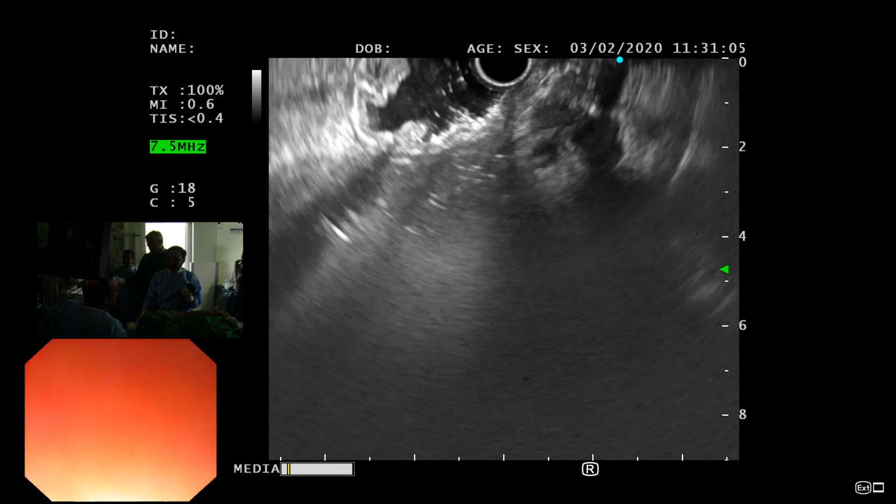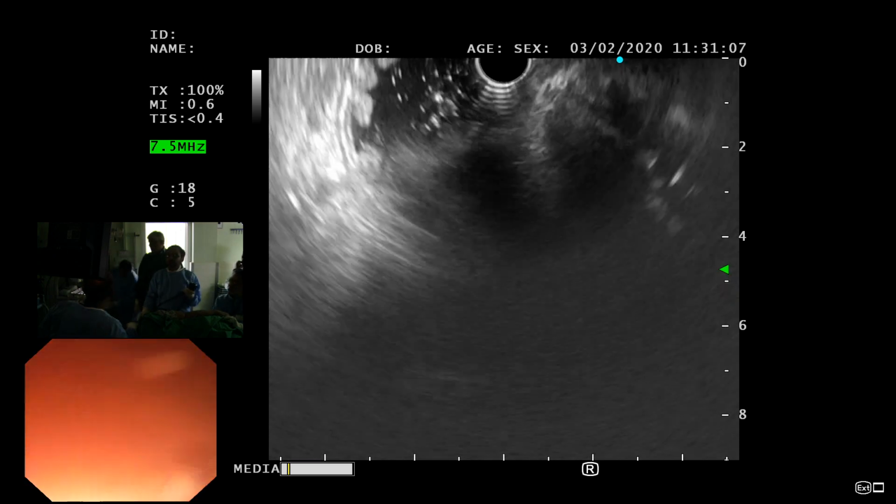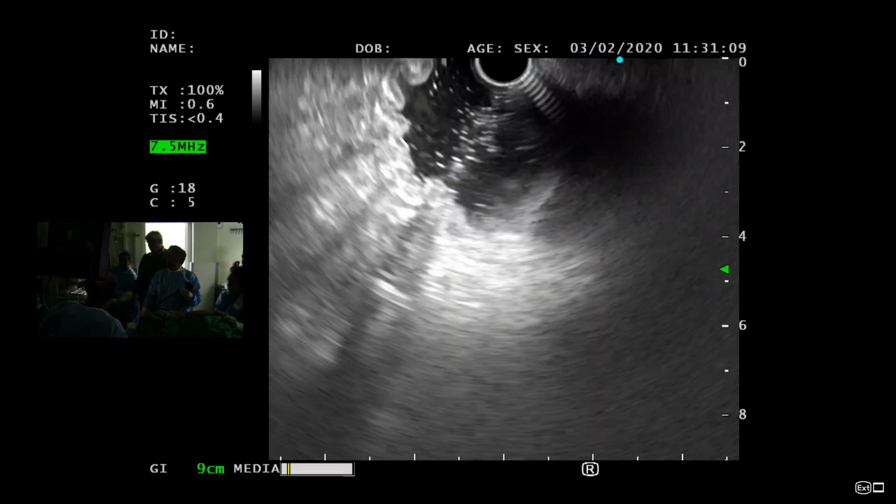Just go on endoscopy, please. You have the option of going full endoscopy, which is not a bad idea, especially in a.